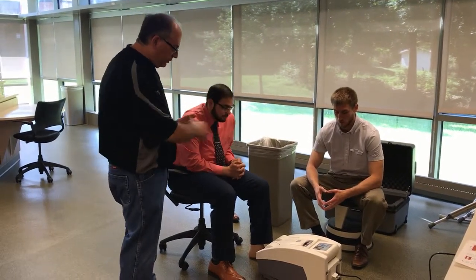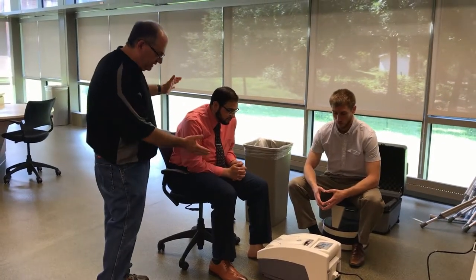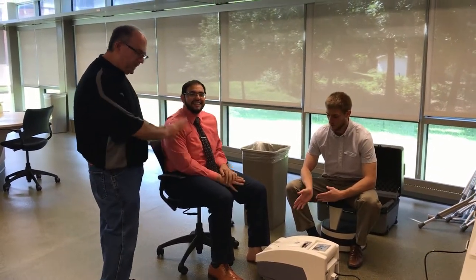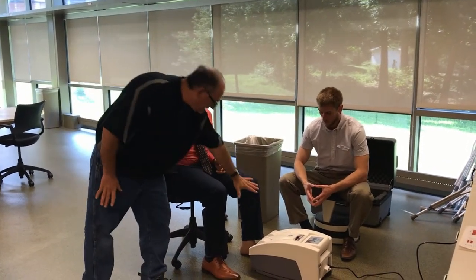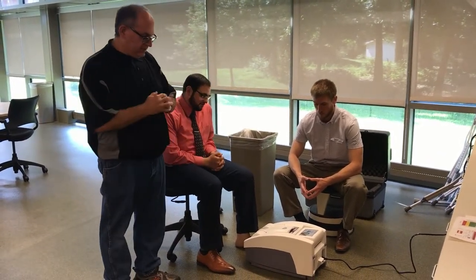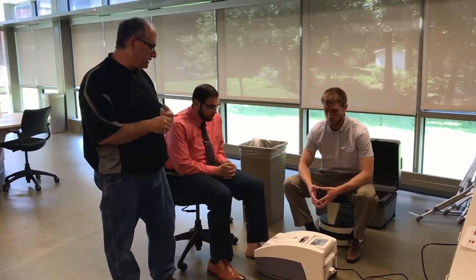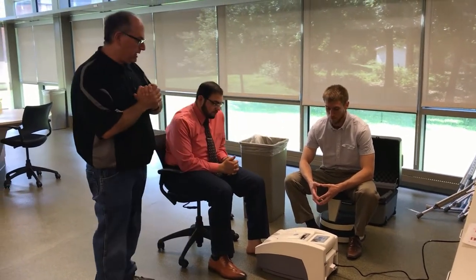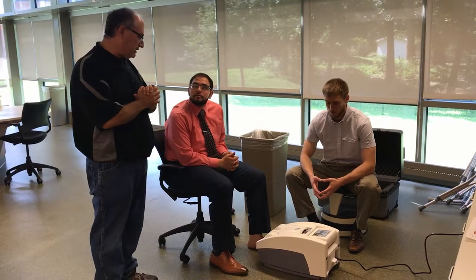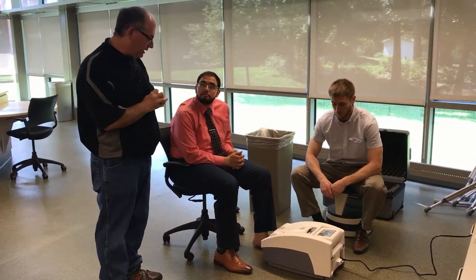What's important here is to see the general setup. Typically, you're going to have your patient seated comfortably in a height-adjustable chair, preferably facing the machine like this. The pharmacist then — we have our pharmacist on a nice, comfortable stool. Chairs themselves are sometimes too high to comfortably run the touch screen, but you don't have to sit down.